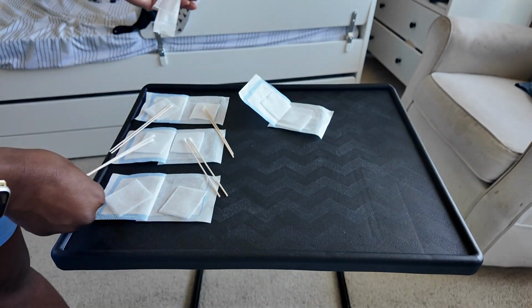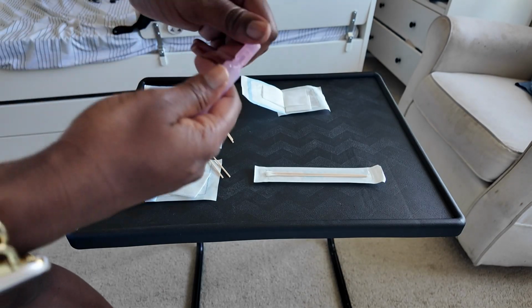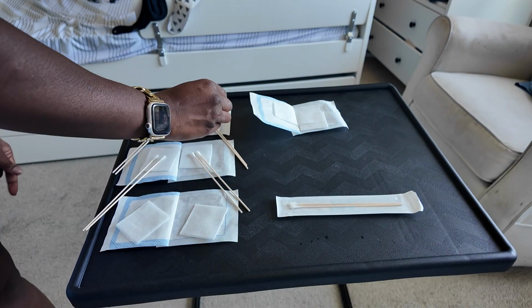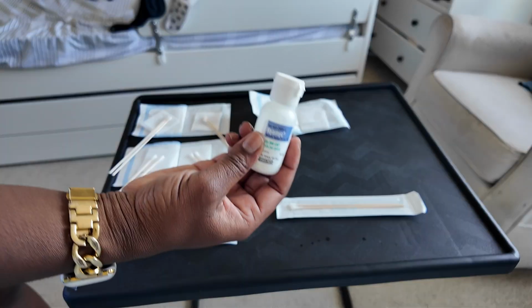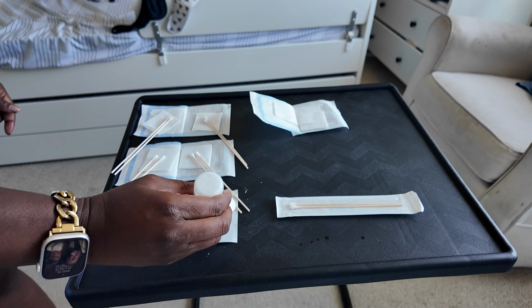Today, you won't see her exact stoma. You will see something. So disclaimer, this might make you uncomfortable: a stoma is the opening of her trach, but I don't want to show too much, just enough for you to really understand. So what I just used was saline to wet the top Q-tips. That is what we're going to use to clean. The next row is what we're going to use to dry.